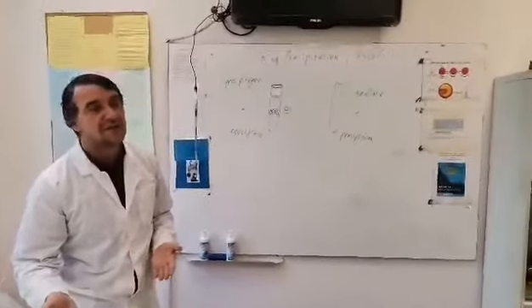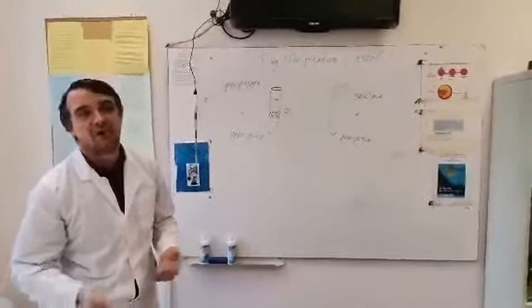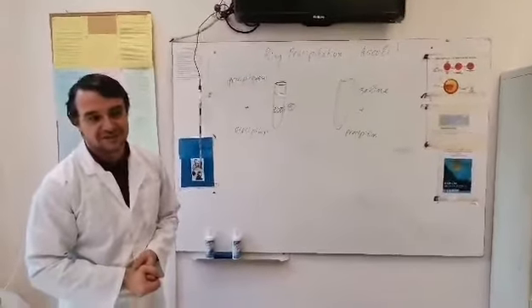But as you see, it's one of the reactions that happens almost immediately, just within several seconds.